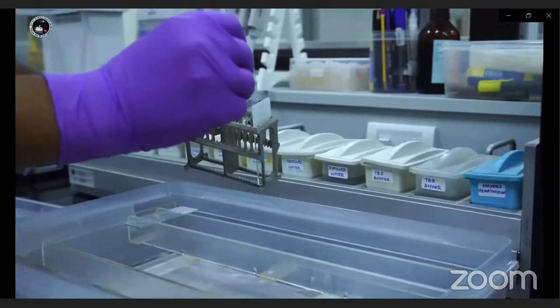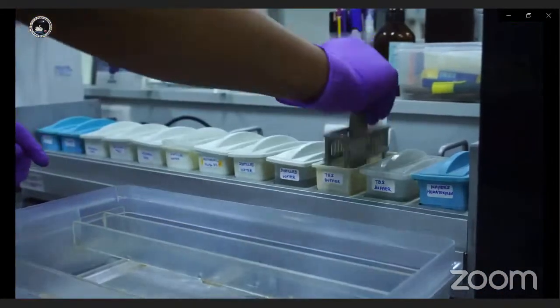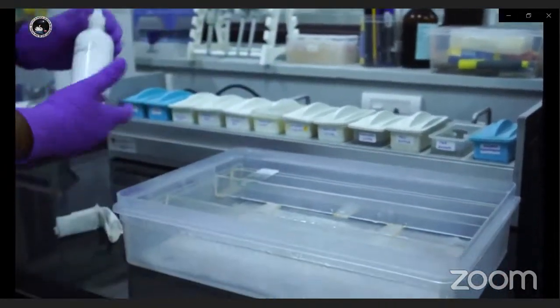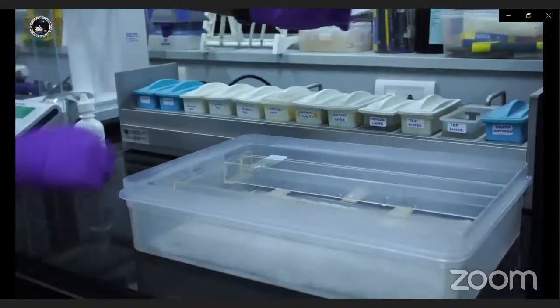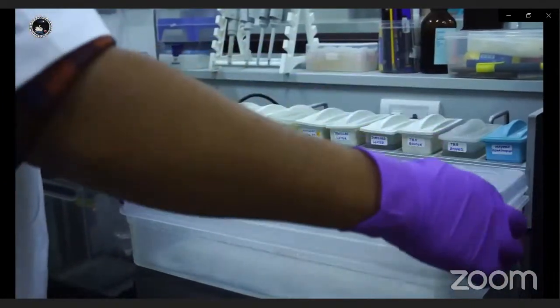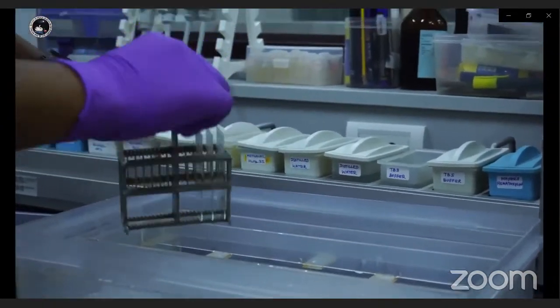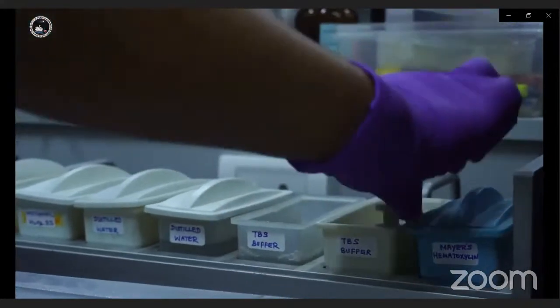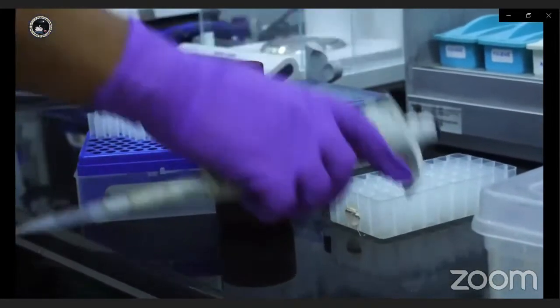After incubation, wash the slides in TBS for 5 minutes, 2 changes. Wipe the slides around the sections in order to remove excess buffer. Apply secondary antibody as per the company protocol. We are using the DAKO Envision kit. Incubate for 1 hour. Wash the slides in TBS for 5 minutes, 2 changes. Leave the slides in TBS while you prepare the chromogen.